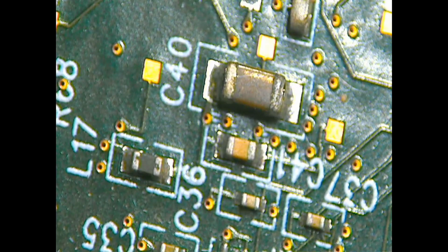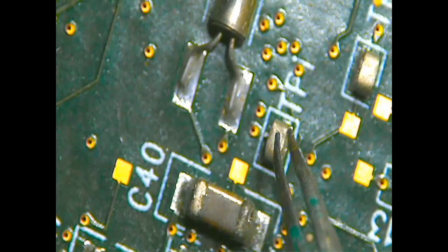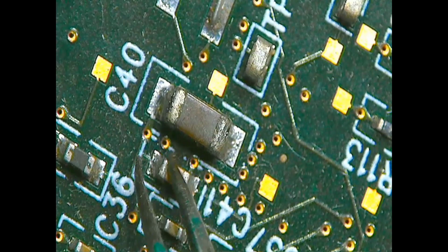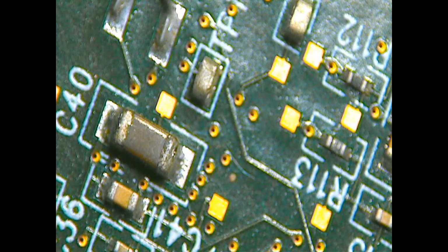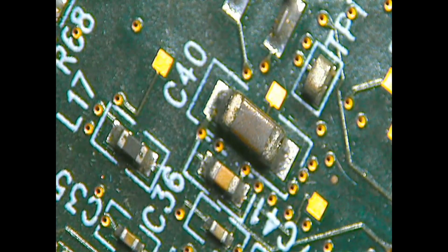But in this case we should apply some of our internal knowledge. So what I'm going to do is, as my first guess, I will try to remove this big cap, and after that I will check these side components, because these capacitors are showing the half short. So now I'm just going to remove this cap first, and then we will see whether it works or not. So I'm taking my soldering iron now.